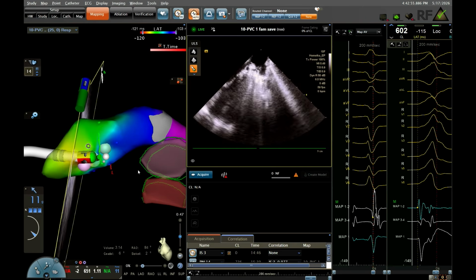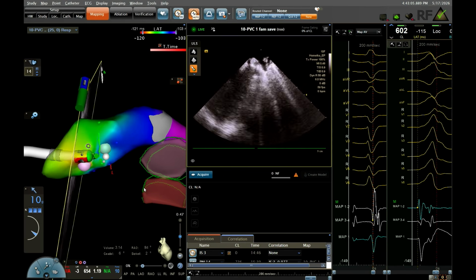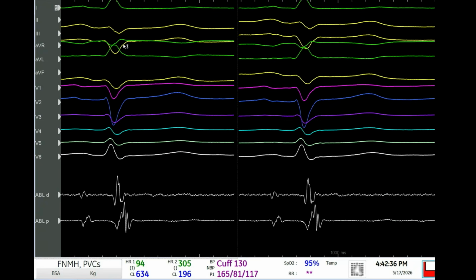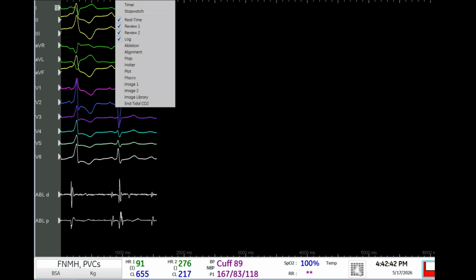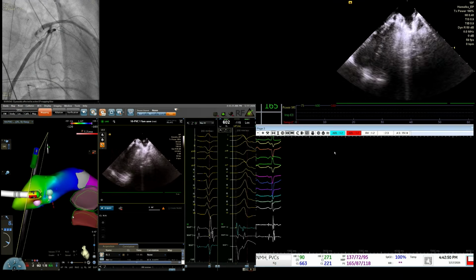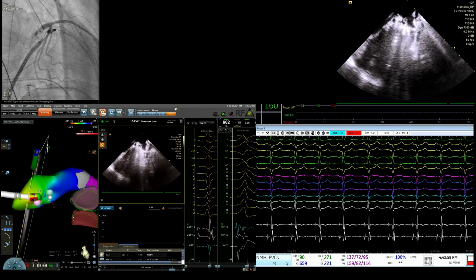I wish we had a PVC so we can ablate and show, maybe live. Wait a little bit. Can you put the screen at 50? Set it starting at 20 watts. What is the impedance? We cannot see impedance. We'll show you. Put the live EKG there also. Put Carto, both, at 160. Yeah, just make it higher for now and see if it works. If not, we'll have to modify the patch, maybe put it on the chest or something. This is good. So we have everything on the screen now. But we're going to start low and see if we can get a lesion here. Sometimes I like to perfuse at the maximum, so can you perfuse at the maximum with Thermocool, please?